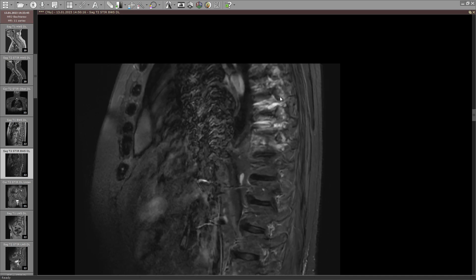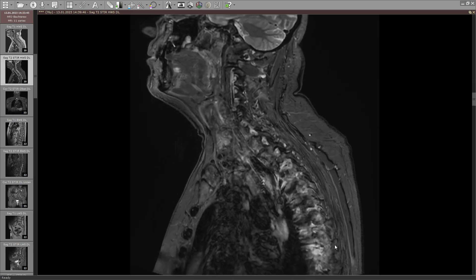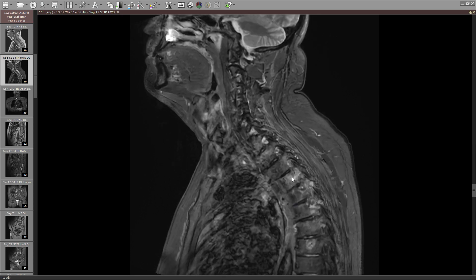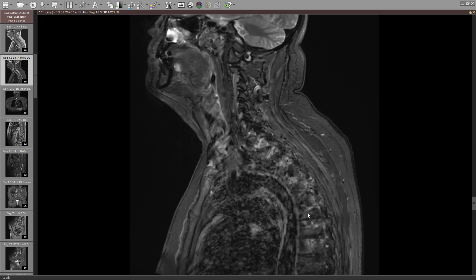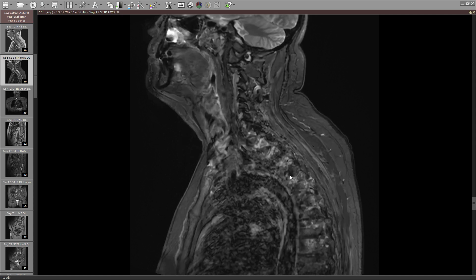This is where we have the ribs coming in, and then we have the joints between the ribs and vertebral bodies and also between ribs and the transverse processes. Going back to the upper portion, we can see all of that — that's too much signal, so that's not normal. On the other side it's a little bit less, more like what we would expect.